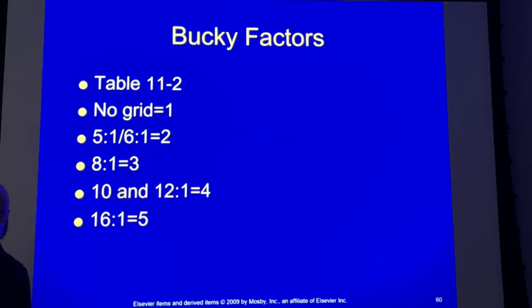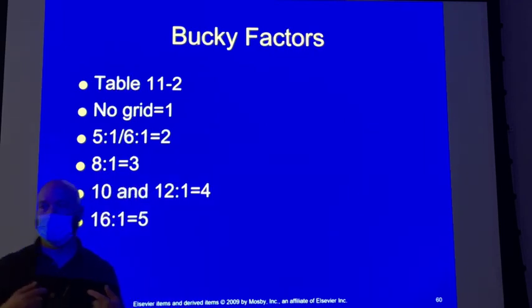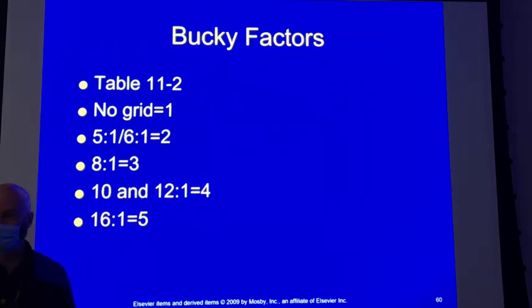So for 8 to 1, let's say you're up on the floor and you're doing a KUB on a patient. Your portable grids are 8:1. There should be a stamp on them somewhere that tells you exactly what the grid ratio is. So if you're up on the floor and you don't have a grid, let's start with that. You don't have a grid, and you're doing an abdomen on a patient for the sole purpose of identifying feeding tube placement. Okay?